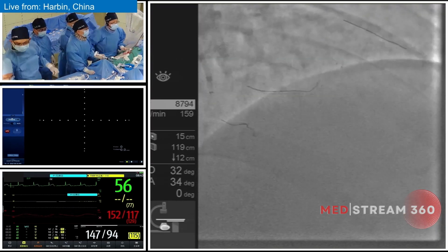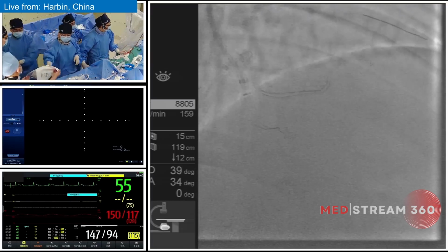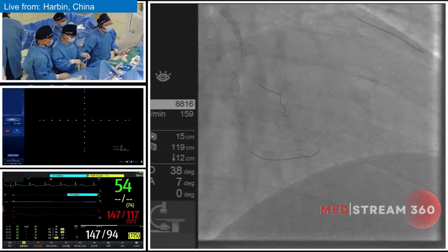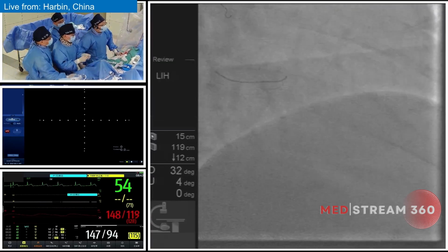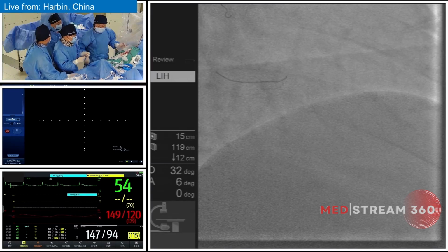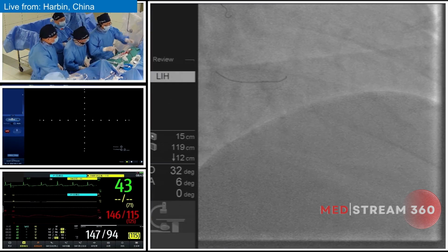Okay. So we are switching to a relatively distal part of the Stingray balloon to make a second attempt of the ADR wire puncture. Like the demonstration of Professor Lee, there are several very important things during the antegrade ADR technique.